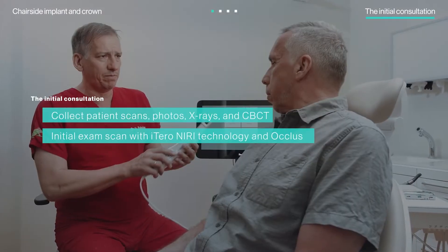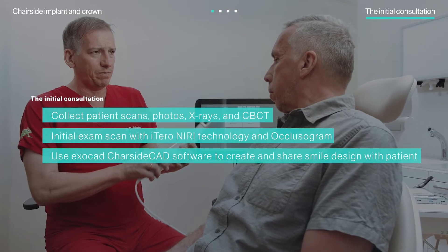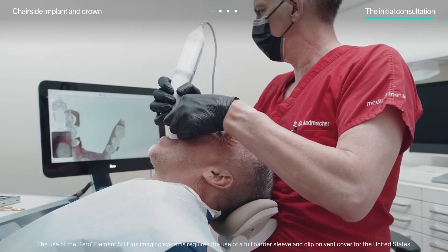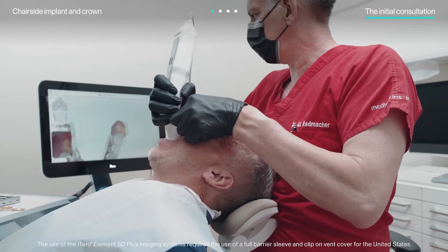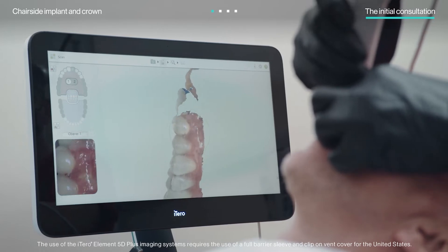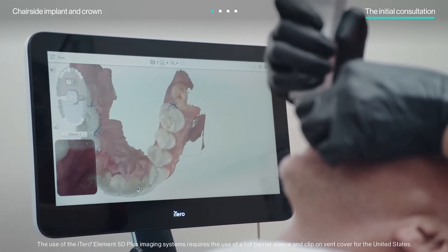At the initial consultation, Dr. Radmacher performed all the necessary examinations for a proper diagnosis. Key to preparing the diagnosis was his iTero scanner, which gave him the opportunity to examine the patient's occlusion from multiple angles, as well as check for interproximal caries using the iTero NIRI technology.